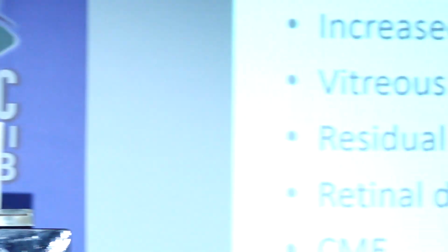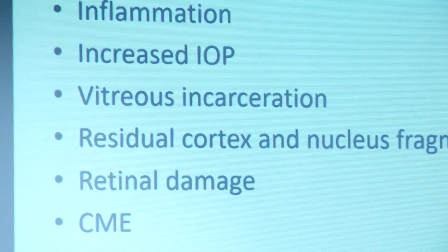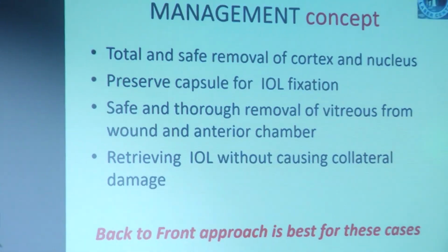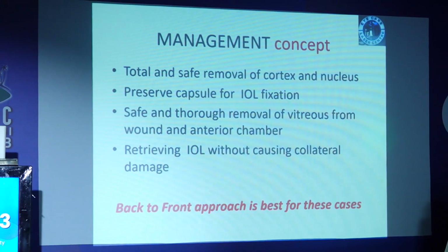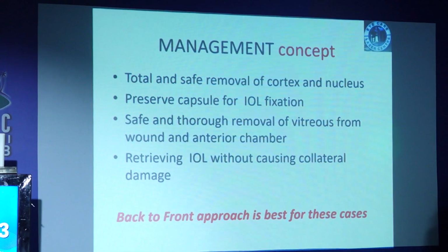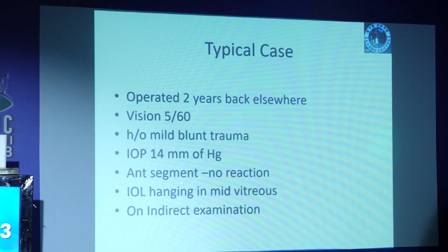So these are the factors responsible: preoperative, peroperative, postoperative, subluxated IOLs, PCD, PCR, zonular dialysis, trauma, accompanying complications, inflammation, IOP increase, vitreous, retina damage, CME. The management concept is basically that a back to front approach is best for these cases. Most of the cases I'll be showing without taking the IOL out.